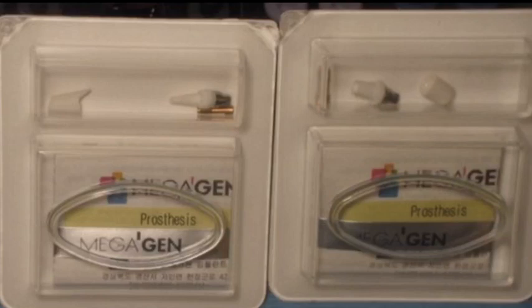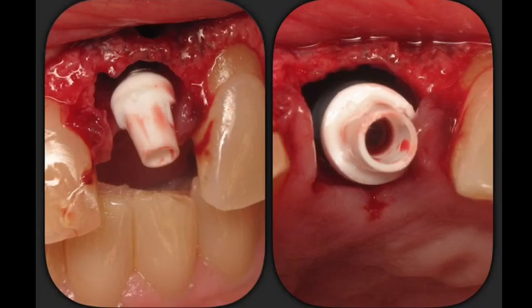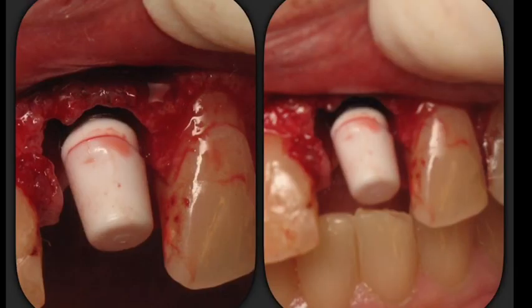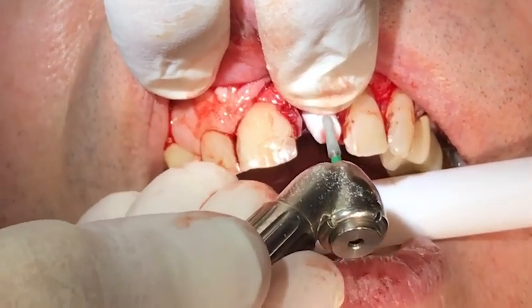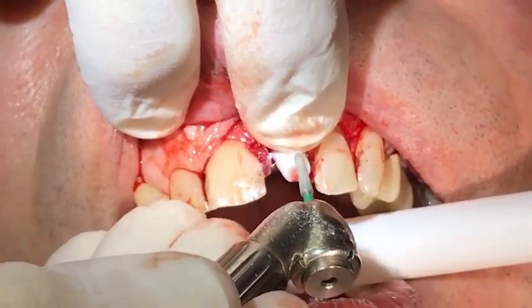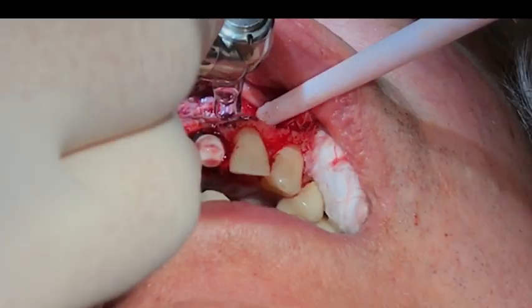Megagen fuse abutments, which are used for provisionalization, were evaluated as to which configuration would suit the situation. Three angulations — 0, 15, and 25 degrees — were evaluated and the one that allowed the greatest freedom of occlusion was chosen. After the fuse abutment was seated, the inner cap was placed over the abutment and trimmed appropriately to allow placement of the provisional restoration.